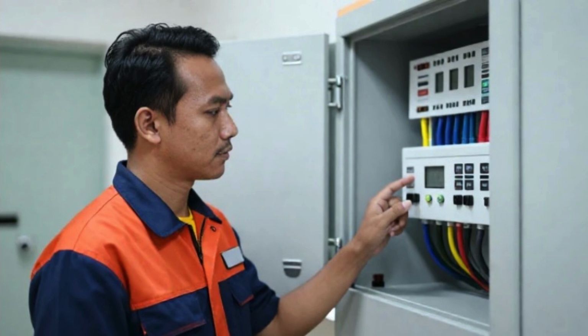One of the most important concepts in electrical safety is electric shock. Electric shock occurs when electrical current passes through the human body. The severity of an electric shock depends on several factors, including the amount of current, the path it takes through the body, the duration of exposure, and the condition of the patient. In medical settings, patients may be connected directly to equipment through electrodes, probes, or catheters, which significantly increases the risk.